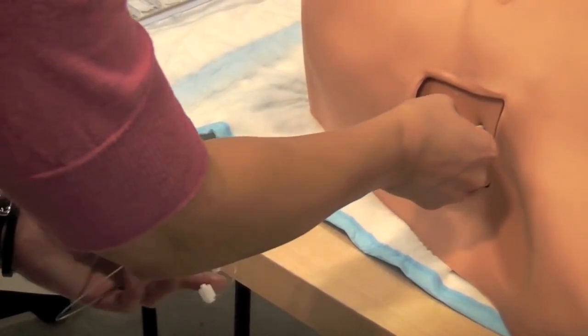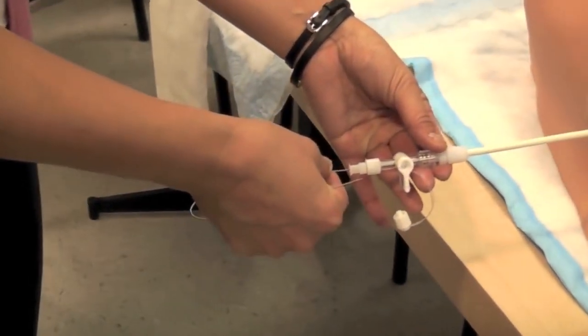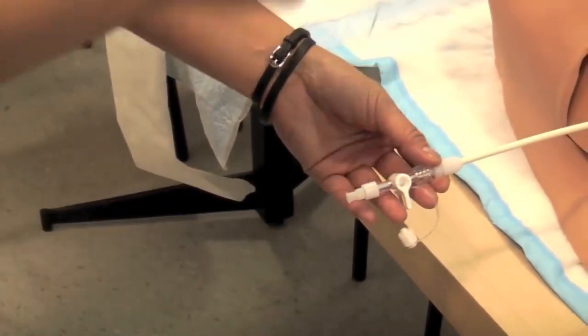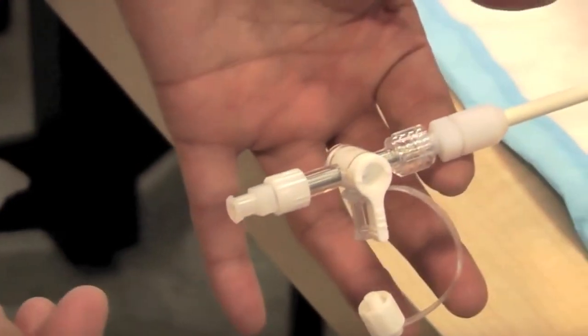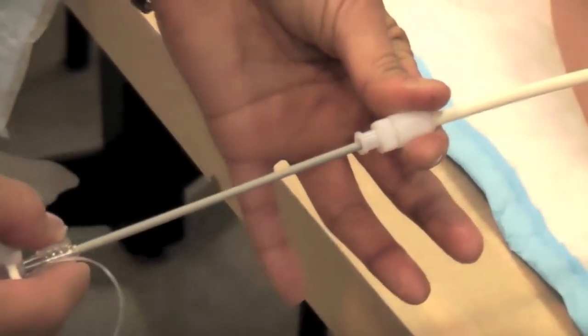When inserting the pigtail into the pleural cavity, the obturator gives you some ability to guide the pigtail superiorly. Remove the guide wire, then remove the obturator and stopcock as a unit by unlocking the luer lock between the stopcock and pigtail catheter.